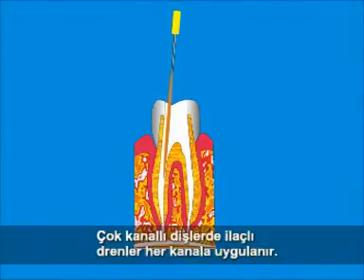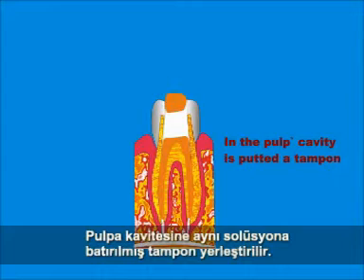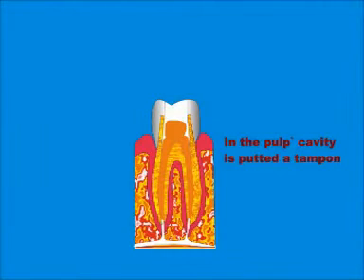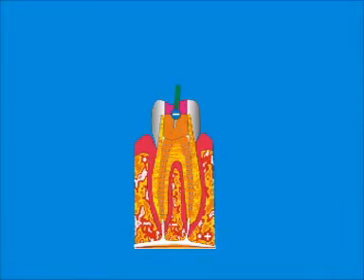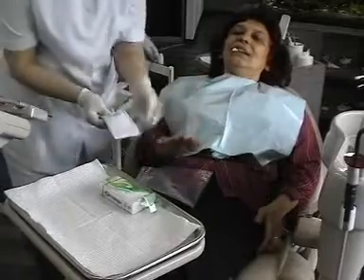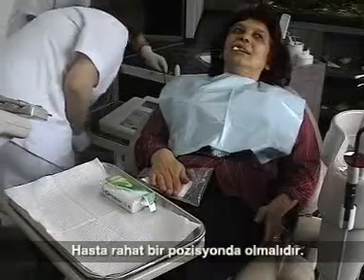In multiple root teeth, the drains with medicine are inserted in every canal. In the pulp cavity is put a tampon soaked with the same solution. The conductor is fixed in contact with the tampon. The patient is placed in a comfortable lying position.